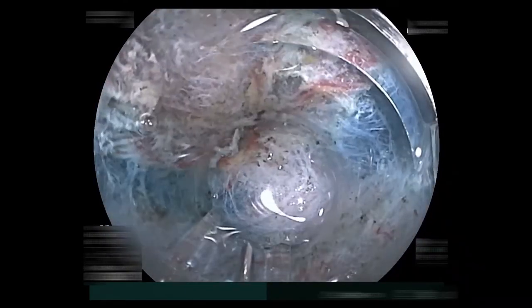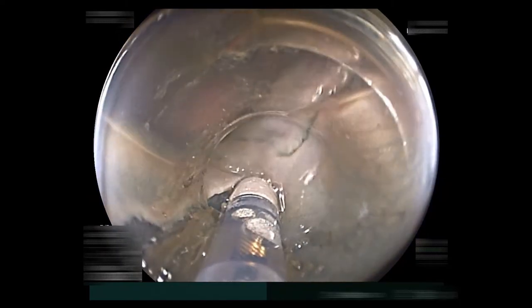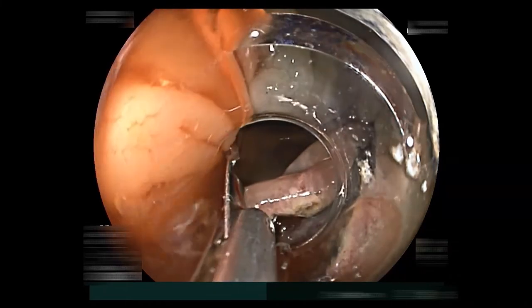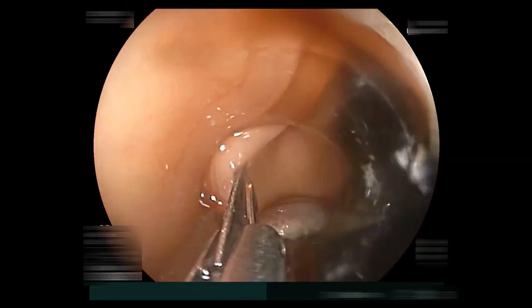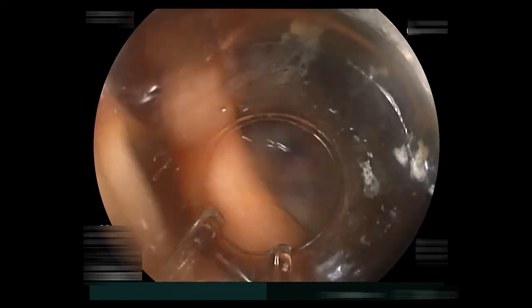Now we encountered submucosal fibrosis induced by a previous biopsy at the local clinic. Though, the clip traction can stretch the submucosa, so we can identify the correct dissection line. After creation of the pocket, we make a circumferential incision. Then we grasp the distal side of the partially dissected specimen, pull back a few centimeters and connect it to the opposite mucosa to provide traction.